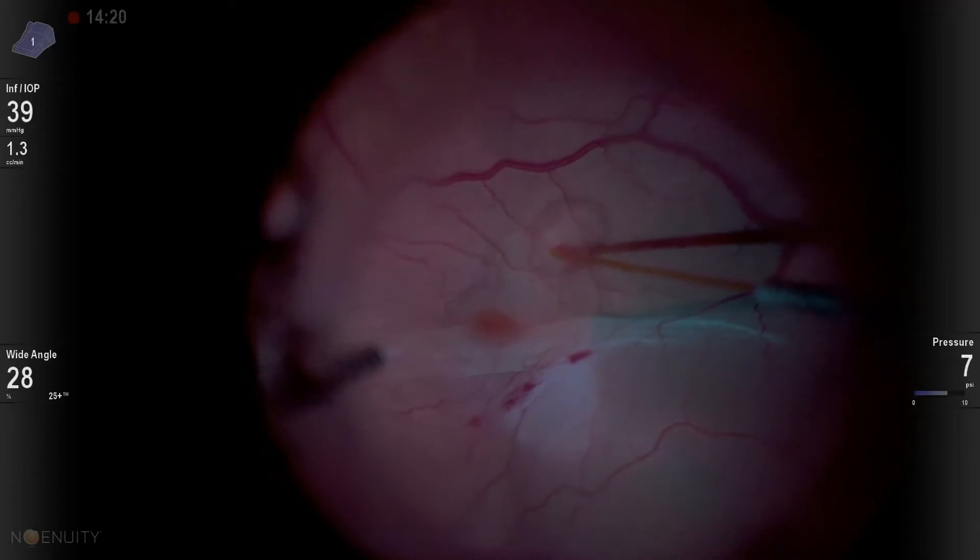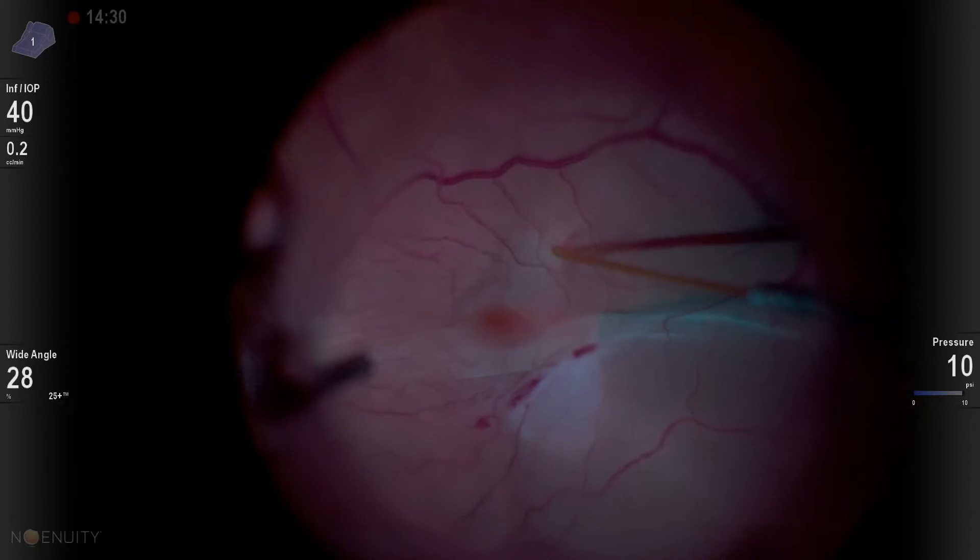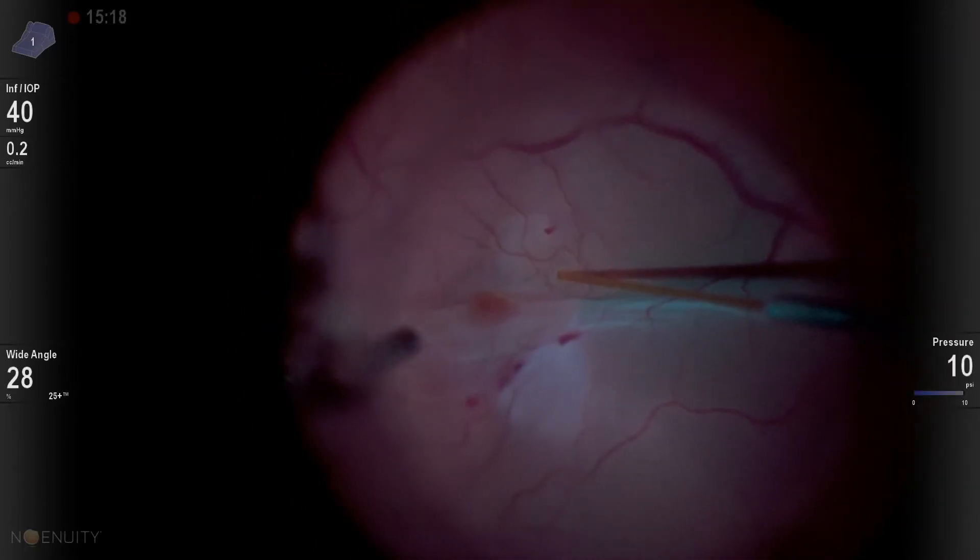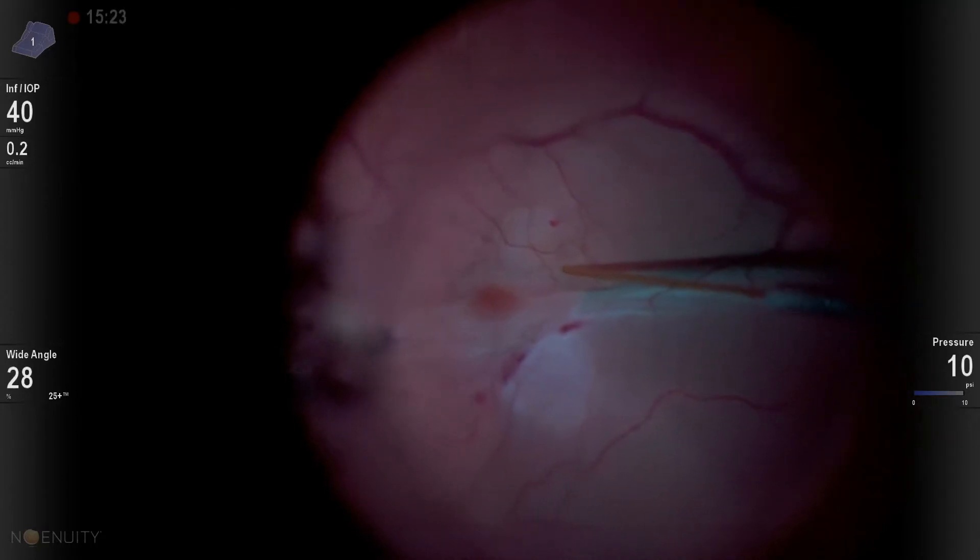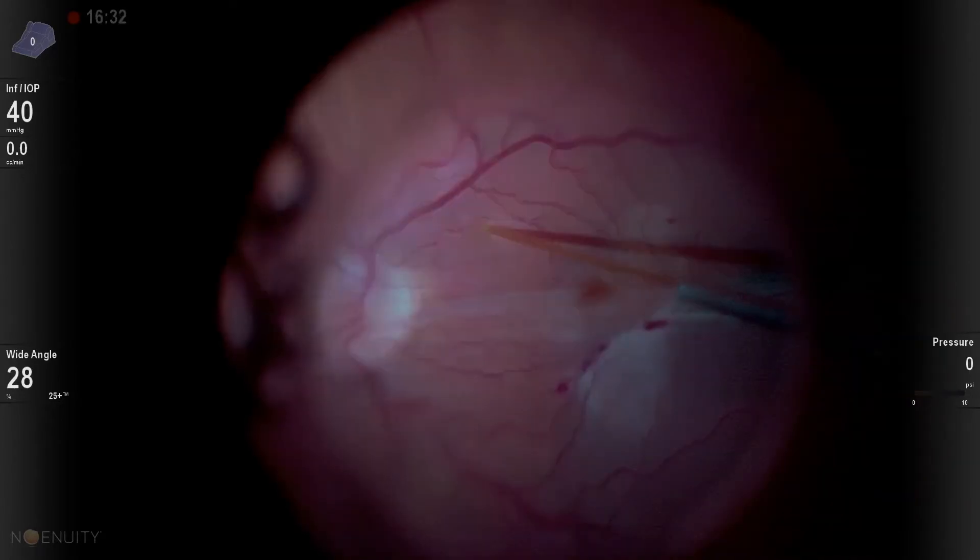But basically what ends up happening is that this bleb now goes out into the periphery. So the blebs are not wanting to go in and unfold the macula, and I tried a third time. Now I'm temporal to the fovea, straight temporal here, and all I get is my fluid dissecting into my larger, more peripheral bubble.